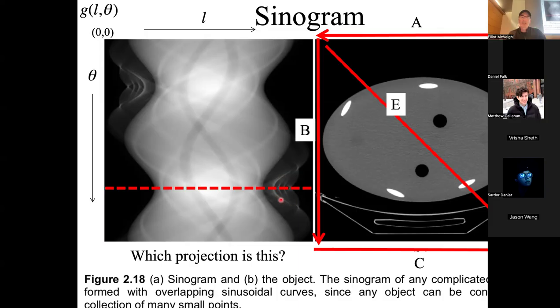On this side, it seems pretty clean. There's a bunch of junk over here when I go from L0 to L large. So that's this junk down here. This stuff is here, and this is free, it's empty, so that gives no projection back onto the thing. So it must be this one. I've got L is little, L is big. I've got this junk projecting back onto my detector here, and the main phantom projecting into this space here.